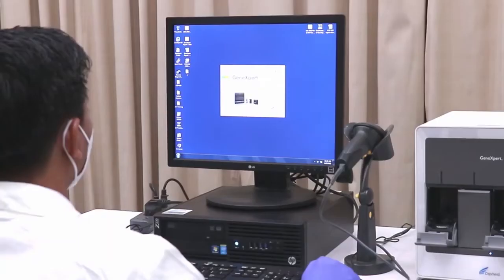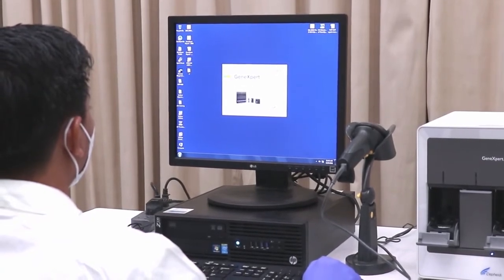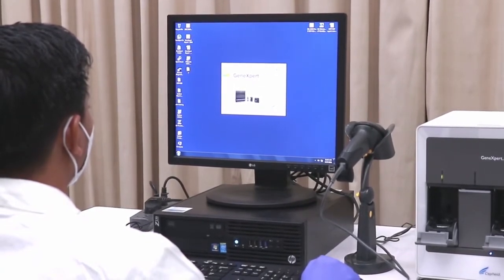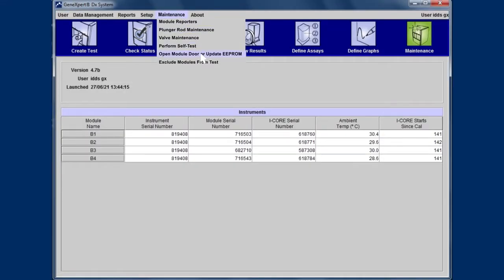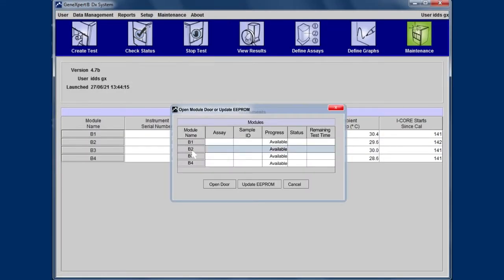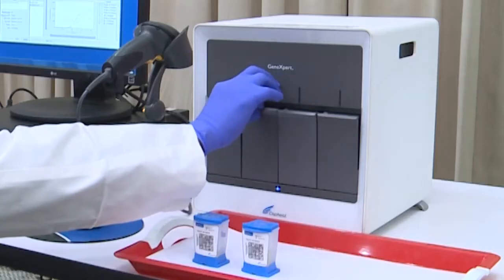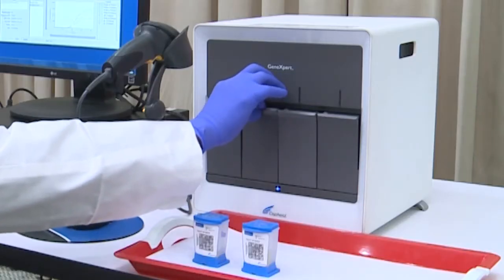If the stuck cartridge is not released, follow these steps to open the module door from the software as step two. If the cartridge is still not released, proceed to the manual release as the third step.